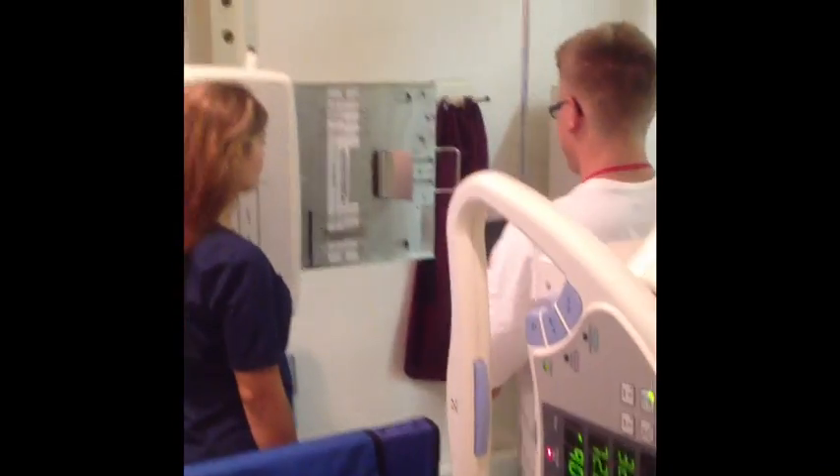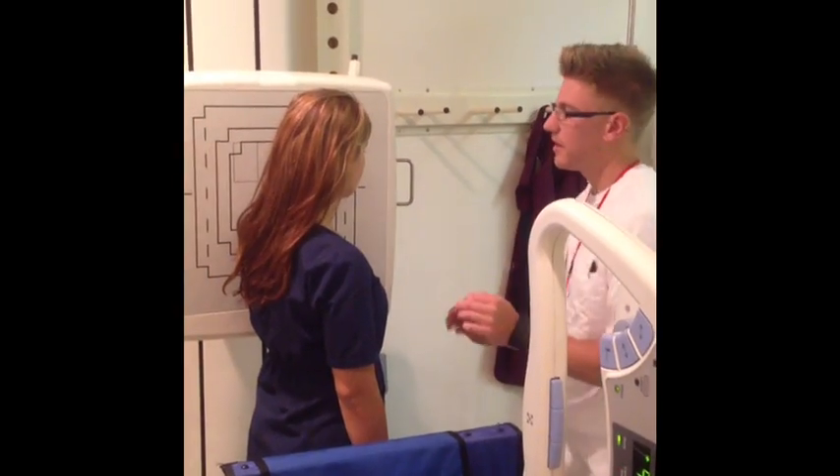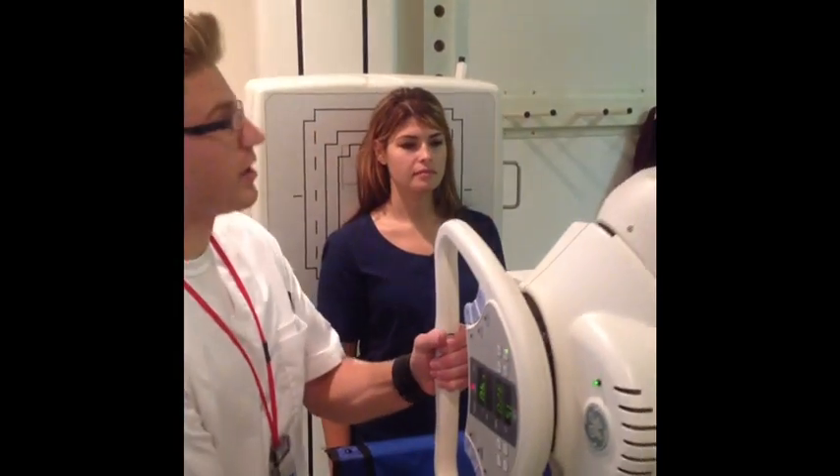Grab another 8x10. I'm going to have you go ahead and put your back against the board. I'm going to move my tube in to 40 inches and put an angle on it.